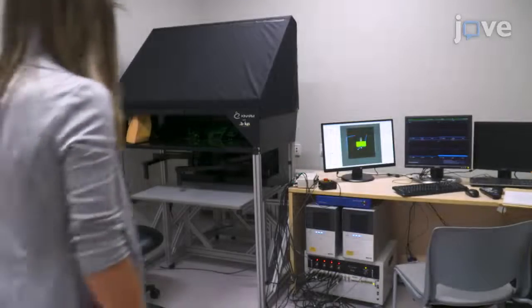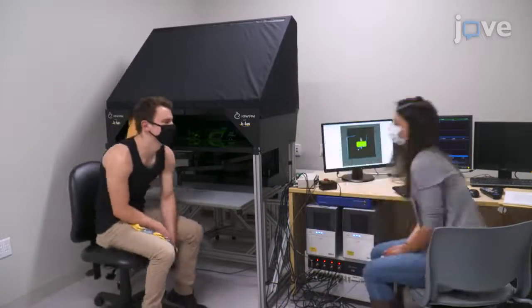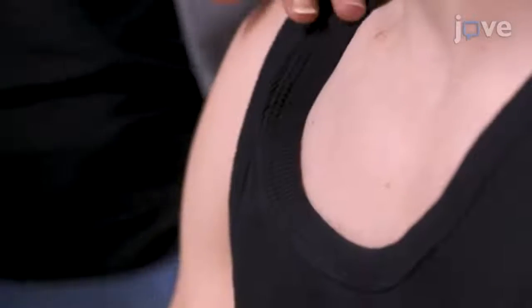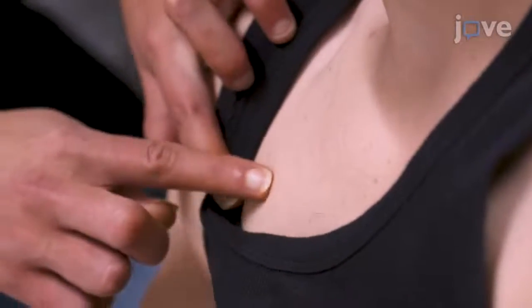Begin by applying electromyography, or EMG, sensors to the targeted upper limb muscle involved in the reaching movement being studied. Visualize the target muscle by requesting an action known to recruit the muscle of interest.